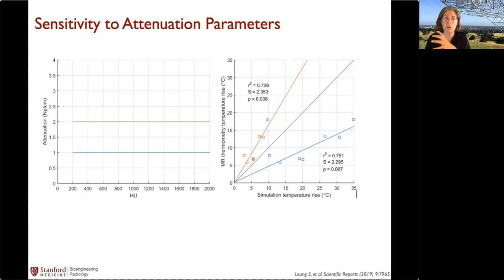In neuromodulation, we care about the temperature, but mostly we're going to care about what this intensity looks like. What is the shape of the intensity? Where is it in the brain? And looking at this data and angsting over the temperature rise is just because it's a good data set, because we've got truth with our MR temperature rise. So that's why I'm spending so much time working on this, because this is a nice validation of beam simulations.